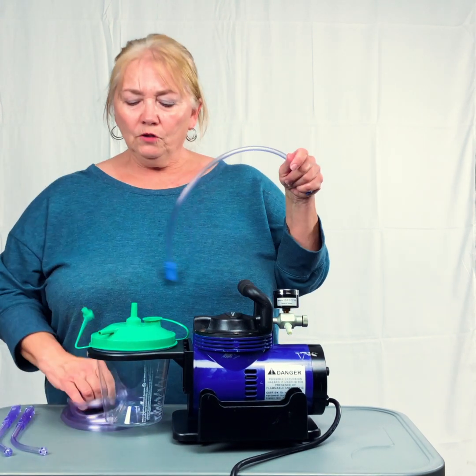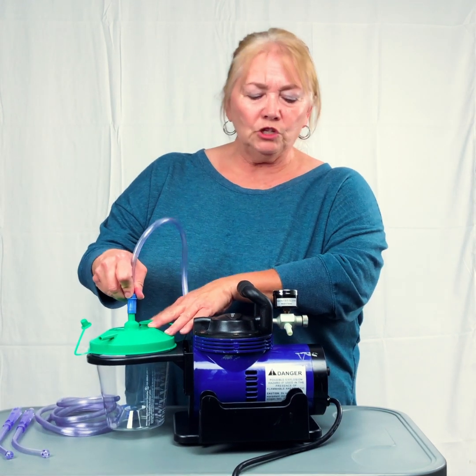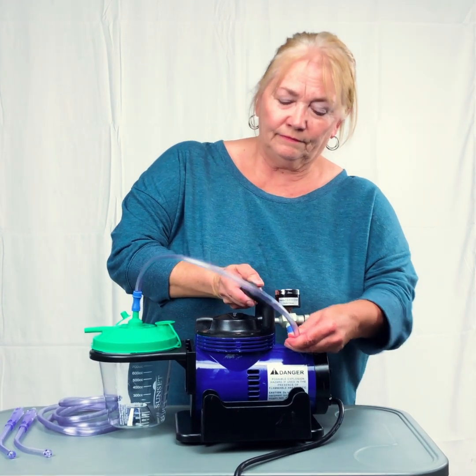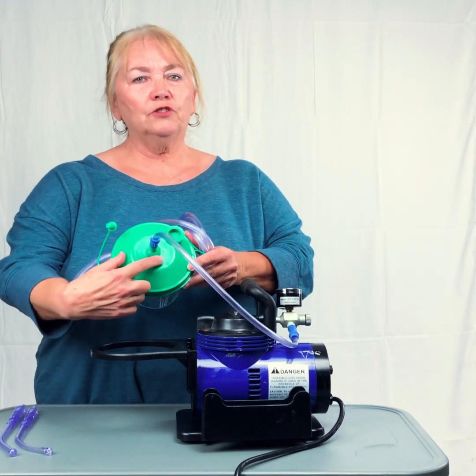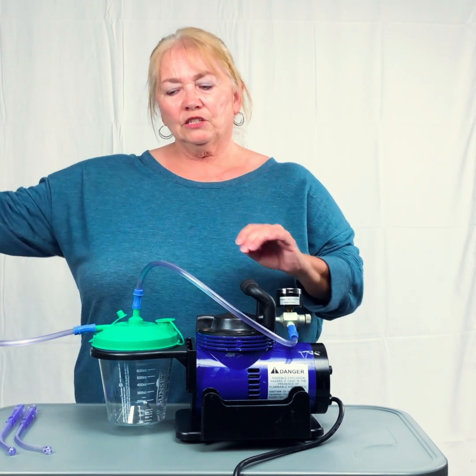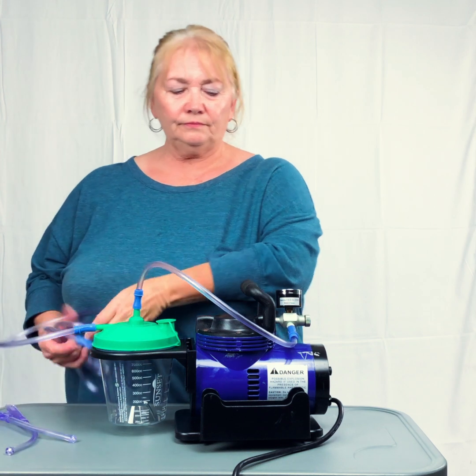You have a short hose and you have a long hose. The short hose goes from the top of the canister to the machine. The long hose goes from the front, and again it has pictures telling you what goes where, and this is what connects to either your yankauer or your suction catheters.